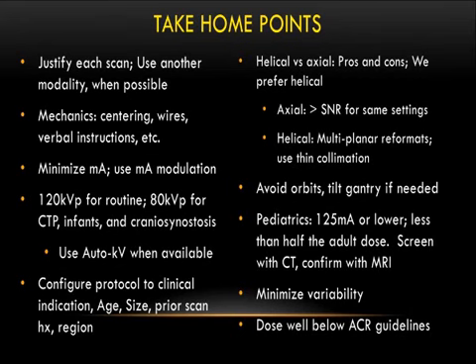I would agree with that, yeah. Because the bony anatomy is fairly clear, and in the brain what we are really looking for is the gray-white differentiation. And I'll show you some clinical examples of how using a higher percent of ASiR can bring those features out. So you would probably use a higher percent ASiR for the reconstructions with the soft tissue algorithm. That's right. And no ASiR for the bony or detail type images. Okay, very interesting.